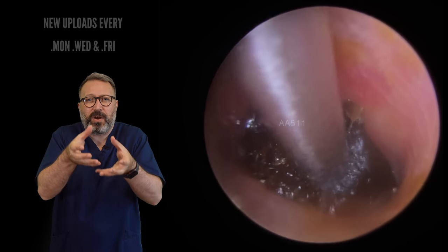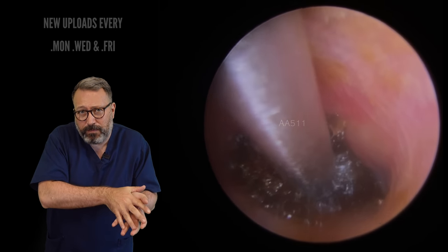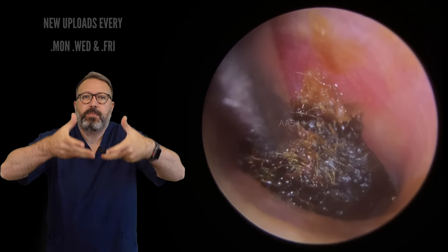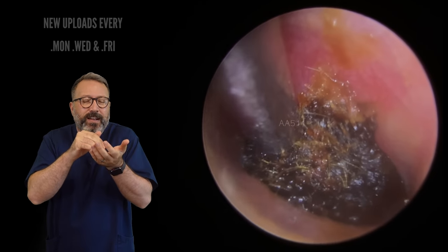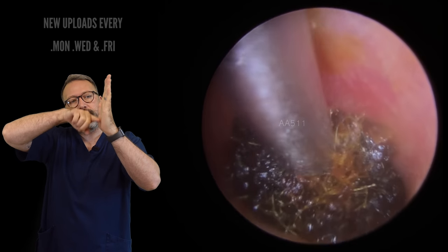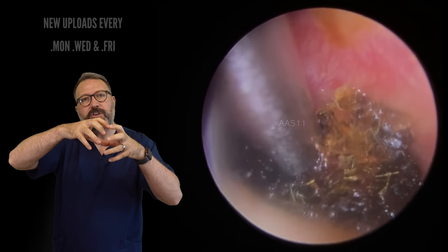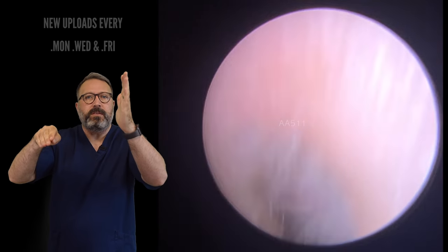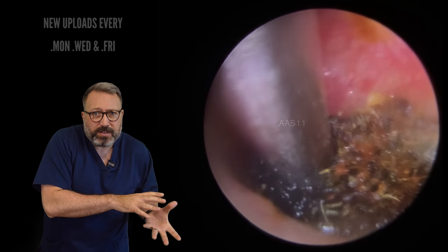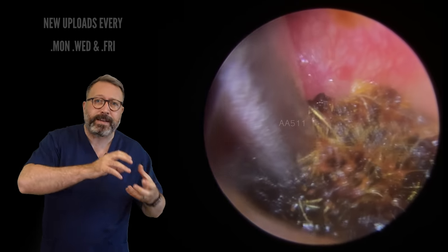It's really important that we get a good suction grip to try and slowly work this back along the canal. At the moment, I'm trying to lift from that bottom right-hand corner upwards, trying to fold the bottom of the wax around so I can get a better grip underneath — so we've got a better chance of pulling it out of that recess just in front of the eardrum, out of that little valley. Just in front of the eardrum, the ear canal flays slightly, so you get this kind of little valley effect. Because this has been constantly pressed, it's squashed itself into that shape. So you've got to kind of lift it up and over that lump. I'm having to switch top to bottom all the time, moving the wax upwards to loosen it from the bottom and then pulling it back down from the top — this constant movement up and down just to try and get this out.